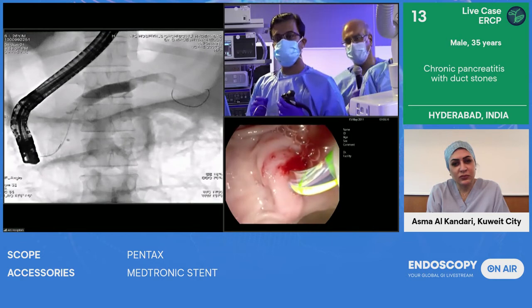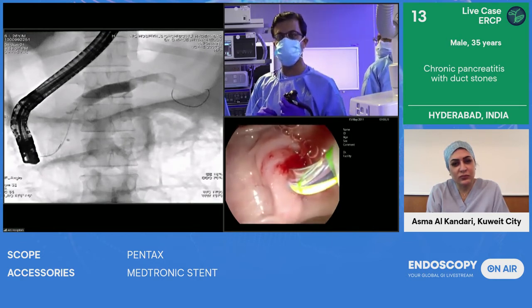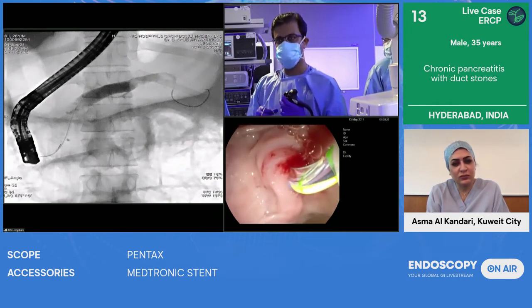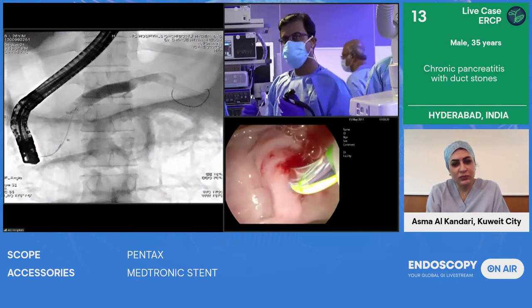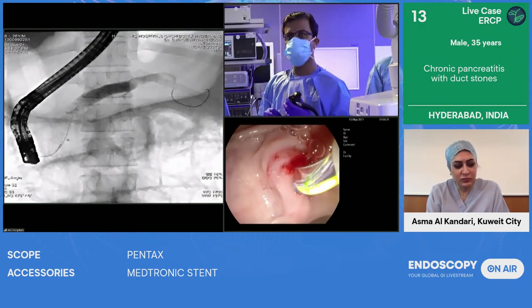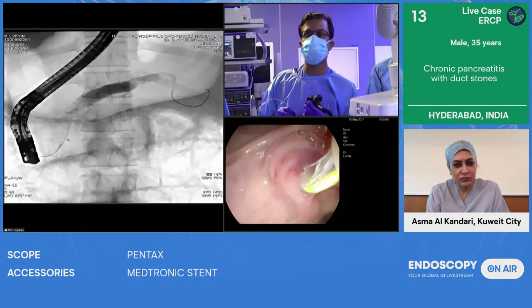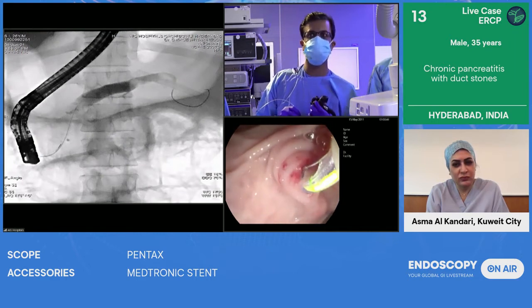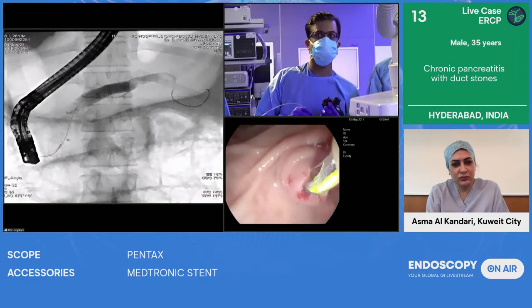Yeah. So what I have done now is I have put in the stiff wire, and with the sphincterotome, I'm going to do the pancreatic sphincterotomy, and obviously my cannulotome is at the 1 and 3 o'clock position. So what I'm going to do is gently lift it. So now I'll be doing a gentle sphincterotomy. I don't need a large pancreatic sphincterotomy because I just have to push in the stent. But because I am contemplating a balloon, I'll do up to the first fold.